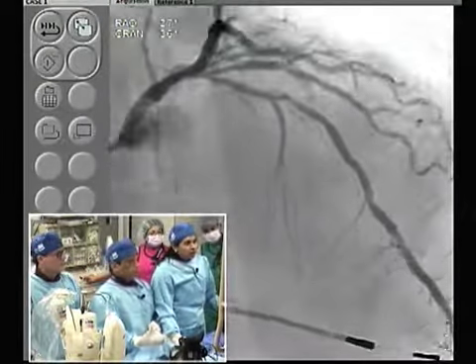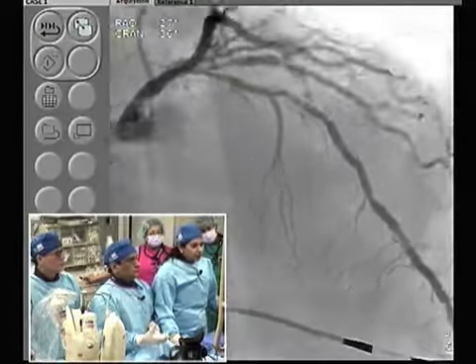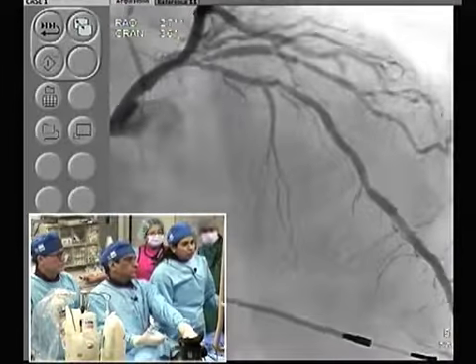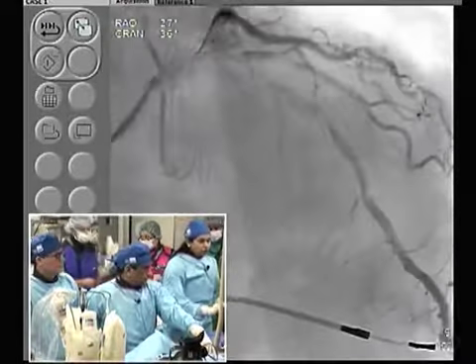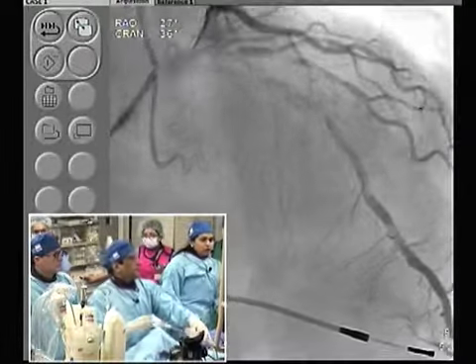When you are there, you start doing your slow pecking motion, and as long as the patient tolerates, you keep going, not more than 20 seconds, come back, and wait in the proximal LAD. You saw that with the second pass we were able to do the rotablation, and then you do your final polish run, which is done, and right now it will be coming out.